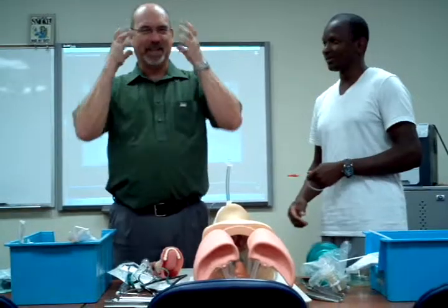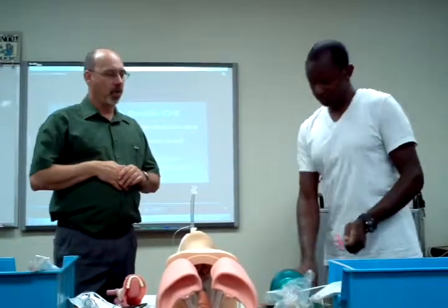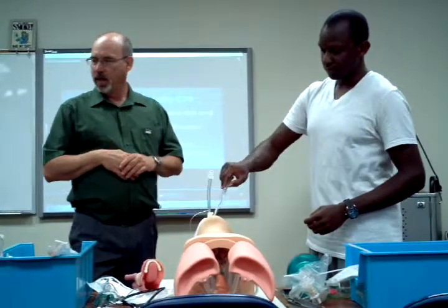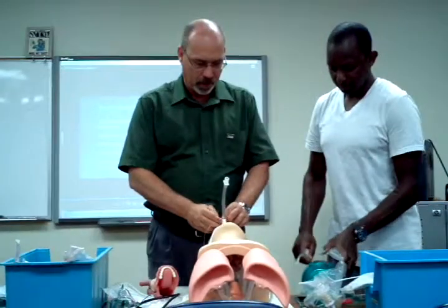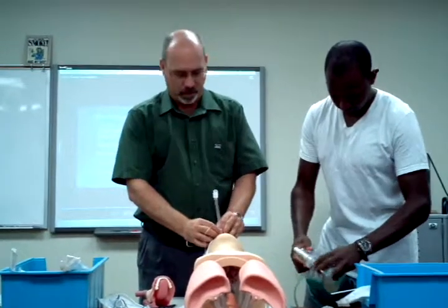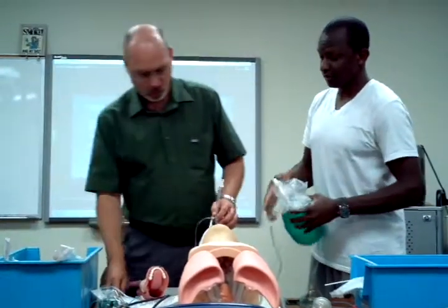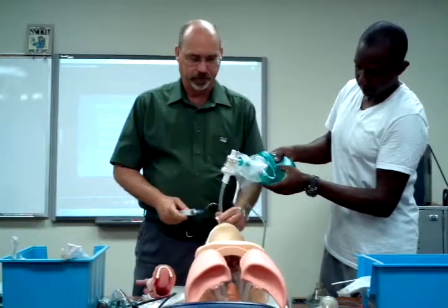We've got our oxygen set up. Let's switch the suction over to the Yankauer. Some of the closed systems now have both available at the same time. You have your resuscitation bag on the oxygen. I'm going to go ahead and start — I'm going to untape the tube. You can cut the tape. Don't forget to explain to the patient what you're doing. Deflate my cuff.